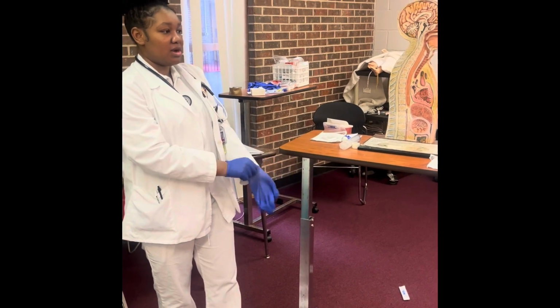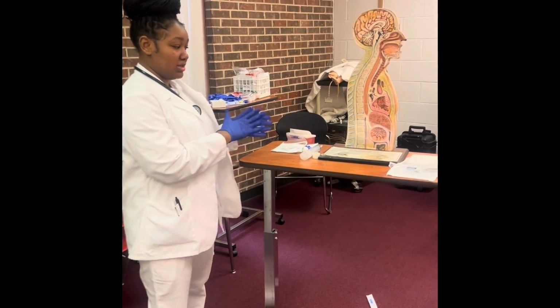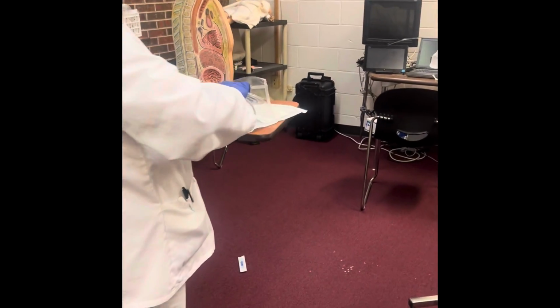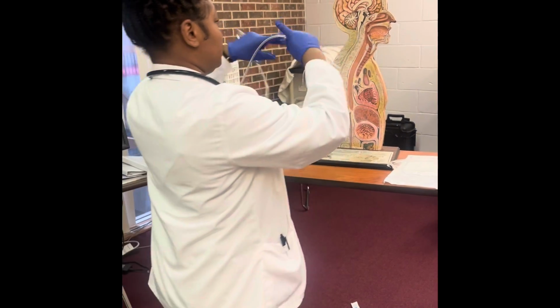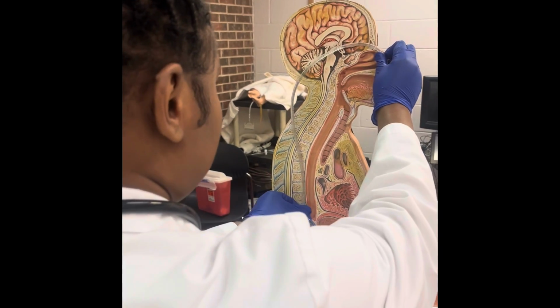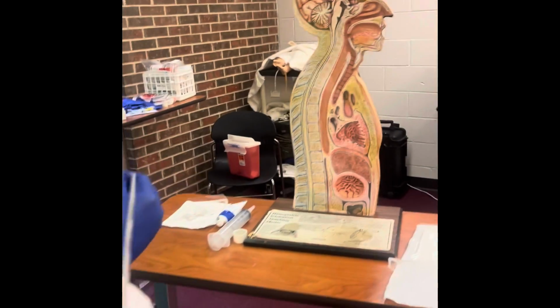And before I came in here, I probably got a towel, some paper towels, or a cup of water or ice chips for the patient to swallow as I'm inserting the NG tube. Okay, so the very first thing I'm going to do is measure it from the tip of the nose, behind the ear, down to the sternum or the xiphoid process. It's about 50, and then I can mark that off with some tape.